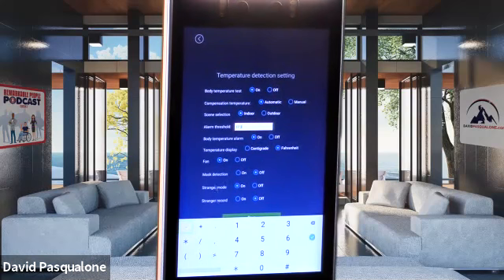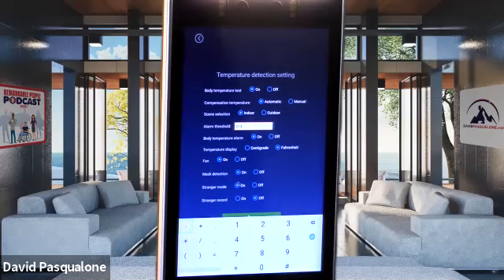So I like to turn the fan on just so it runs and keeps the unit cooler. Now, here are three things that most people don't know about: mask detection mode, stranger mode, and stranger record. If I turn mask detection mode on, it'll scan their forehead even if they're wearing a mask and a hat, and say if they're safe to pass, if their temperature is within the right range, or if they have a fever. And it tells you, okay, you don't have a fever, but you cannot enter here unless your mask is on. So that's mask detection mode.